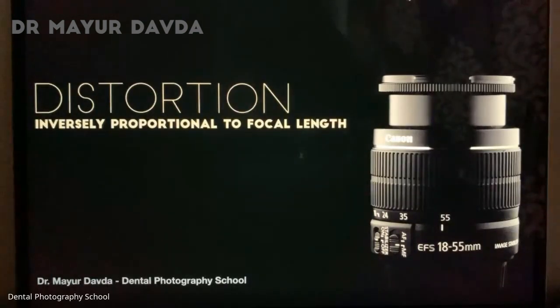Why can we not use this? Number one, this is a zoom lens. Zoom lenses are not suggested for documentation purposes. The other reason is the focal length of this lens is 18-55. I don't want to go into focal length right now, but just keep in mind that it has a very short focal length and it's going to cause a lot of distortion.